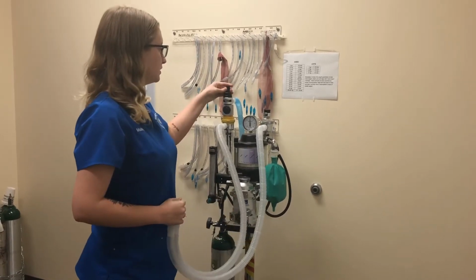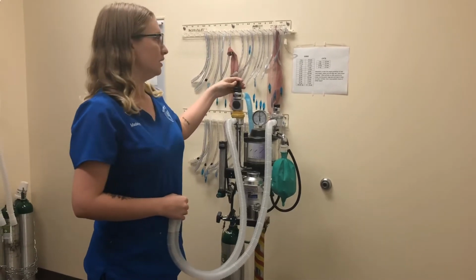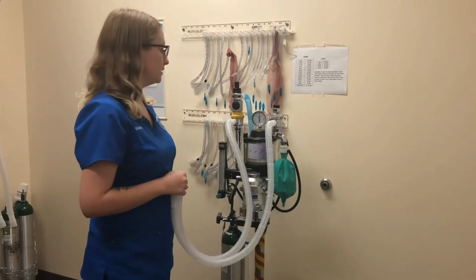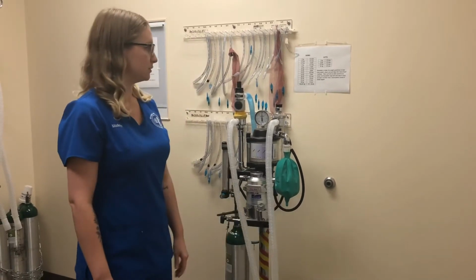You always want to make sure that you open this back up after you have closed it, so usually before walking away from the machine, I keep my hand on this to make sure that I remember to open it back up. Then I'll turn the oxygen off, and our machine is ready to use.